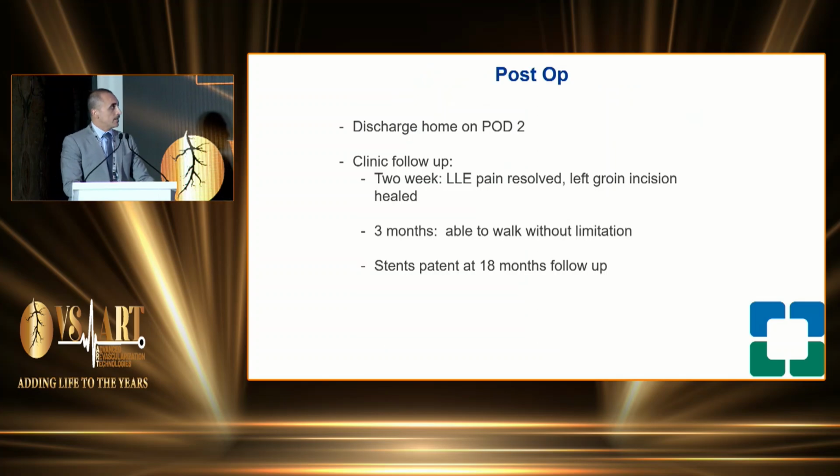The patient did very well. Discharged post-operative day 2, pain resolved, and his stents were still patent at 18 months follow-up on duplex.